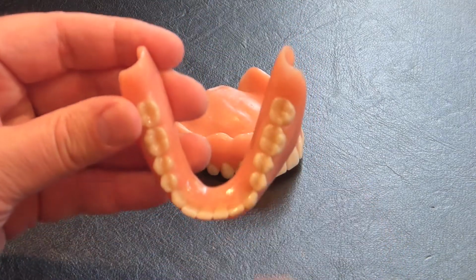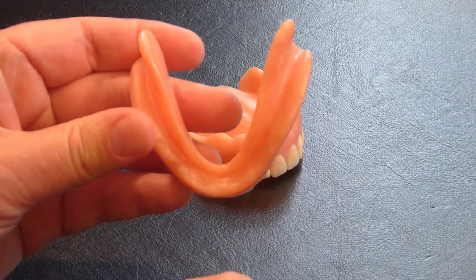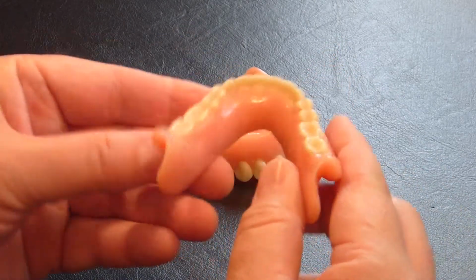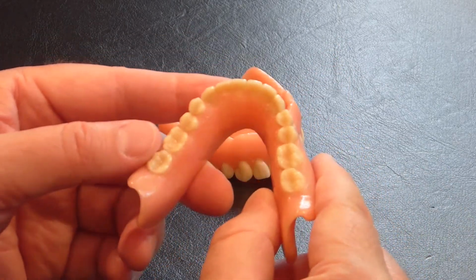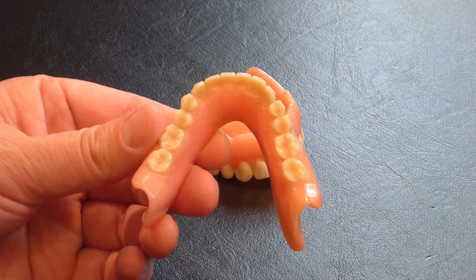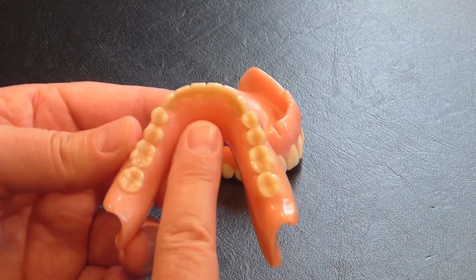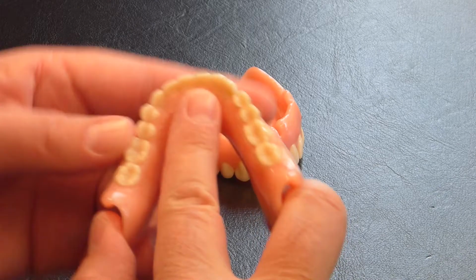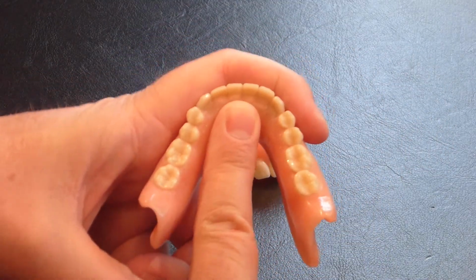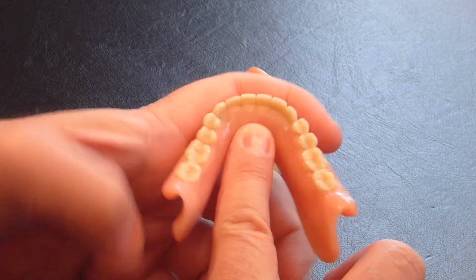The lower denture, because of its shape, shaped more like a horseshoe, you don't really get much suction for it. The lower one tends to just find a spot after some work, some use with it. People kind of will find a position where the tongue pushes it this way and the lips push back on this way, and it helps to keep the denture in place, that balance of force on it from the different muscles.